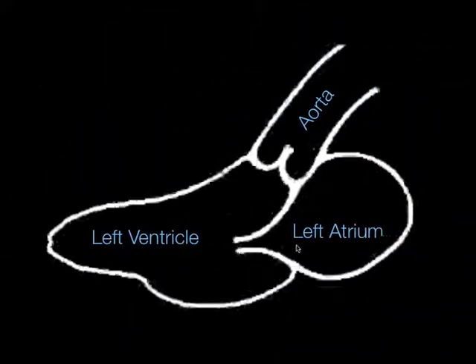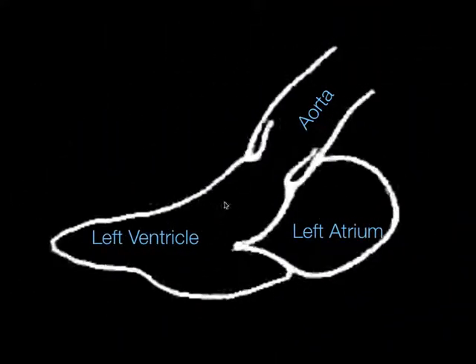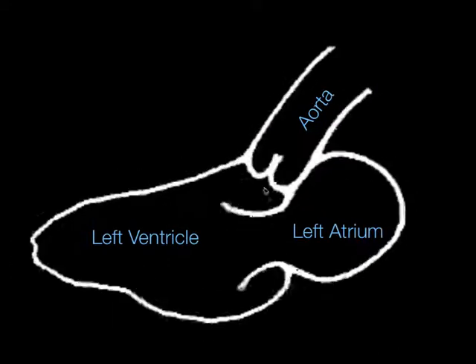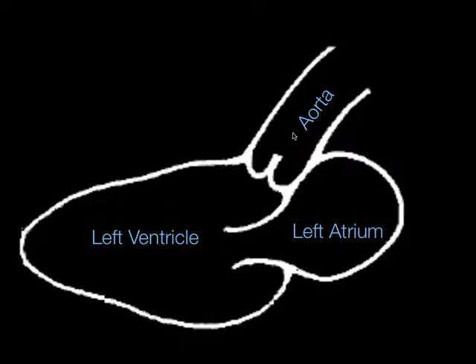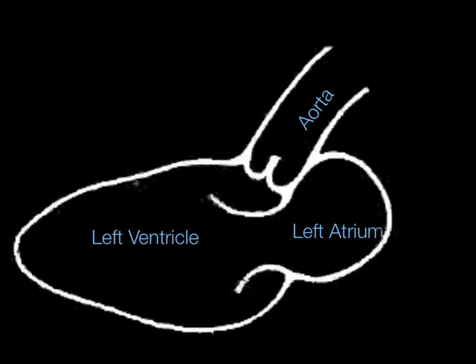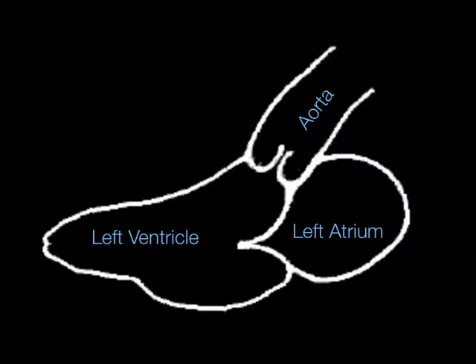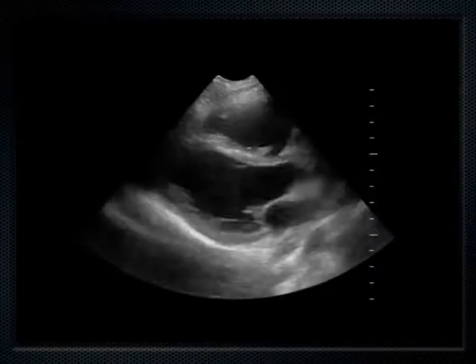And here's the left atrium pumping into the left ventricle and out the aortic outflow tract. We can see the mitral valve here, the aortic valve, we see 2 leaflets of the 3 there, and then just above this left ventricle, recall that is where the right ventricle is.